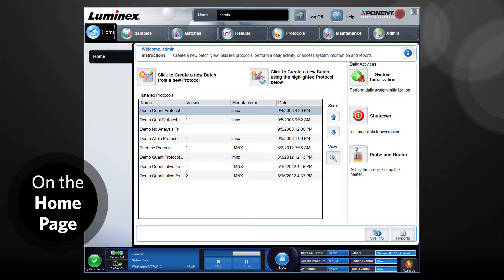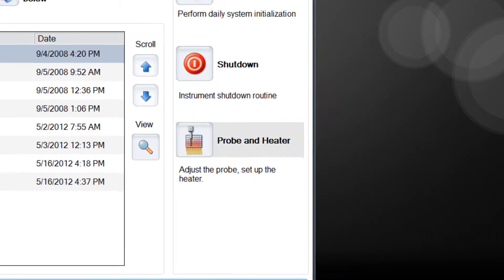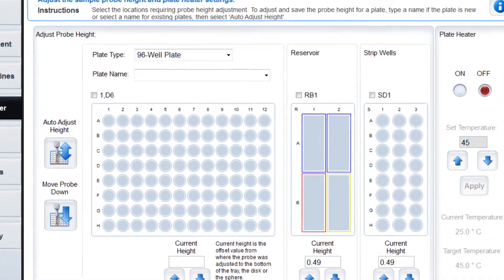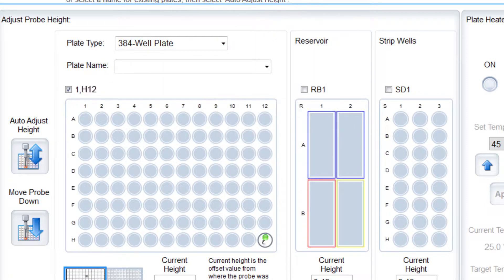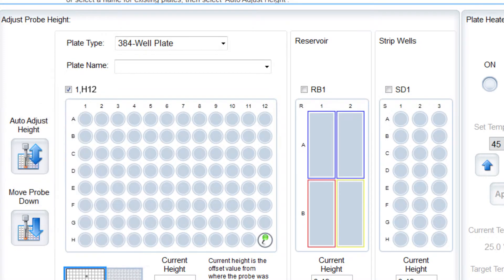On the home page, click Probe and Heater under Daily Activities. The Probe and Heater tab opens. From the plate tab drop-down box, select the 384 well plate layout. Change the default well selection from H12 to the number calculated previously. For this example, well C7.